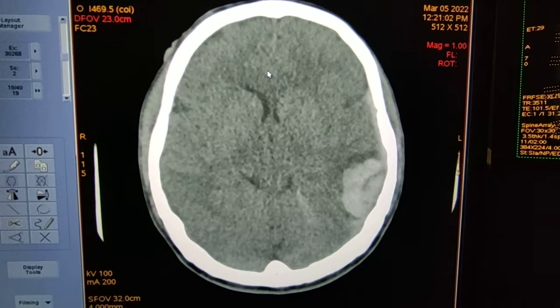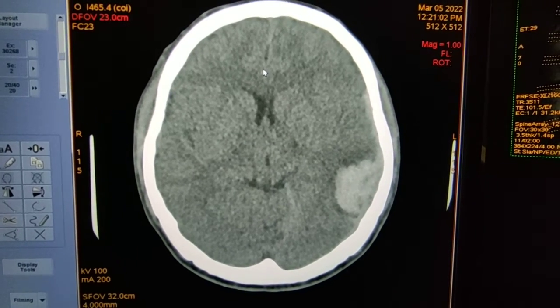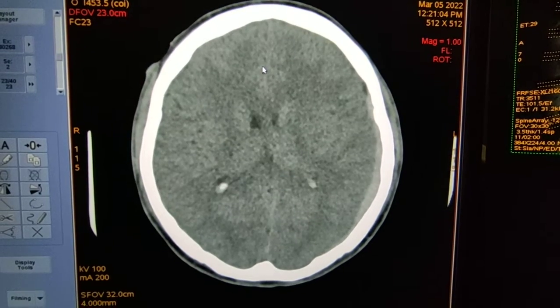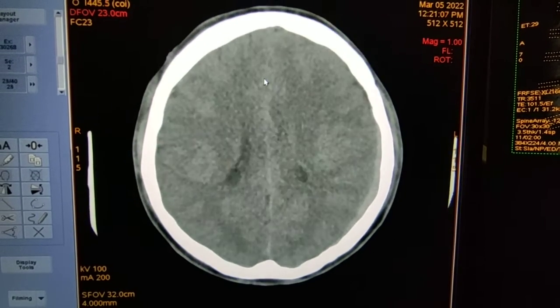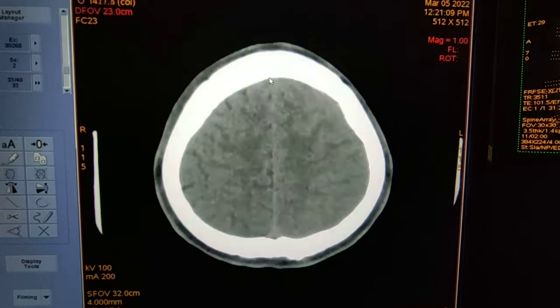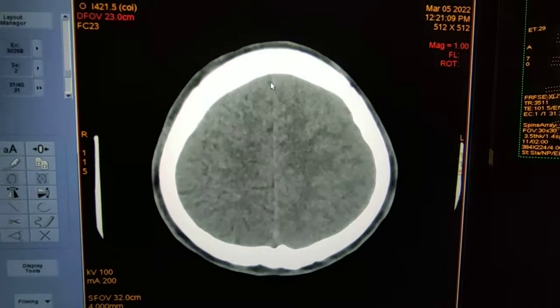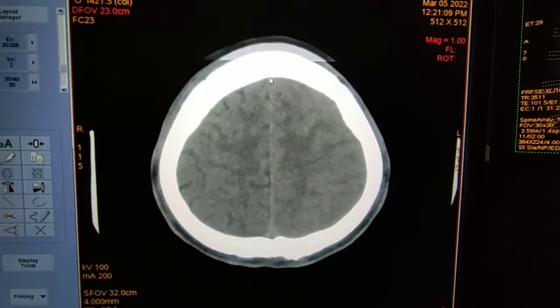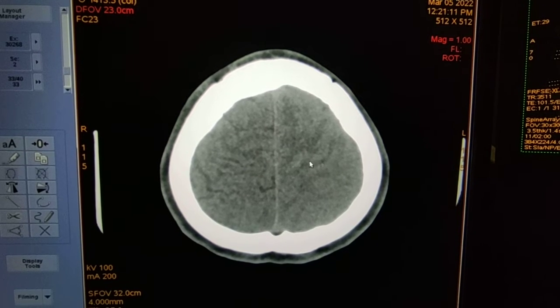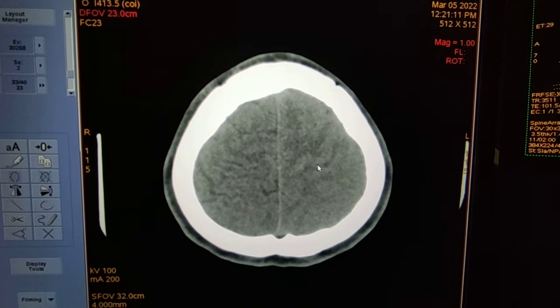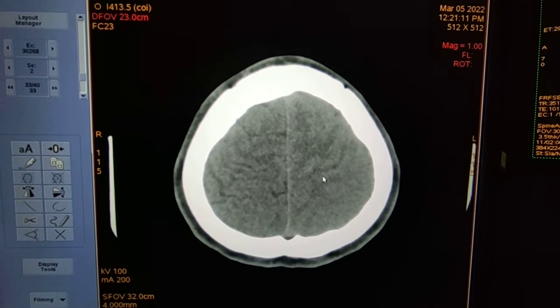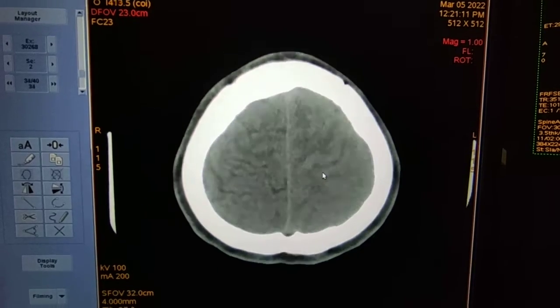Here is thin hyperdensity in the inter-hemispheric fissure — this may suggest inter-hemispheric subdural hematoma. Minimal subarachnoid hemorrhage is also there. Here is the hyperdensity in the sulcals.